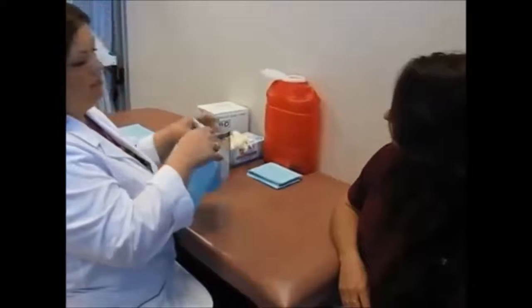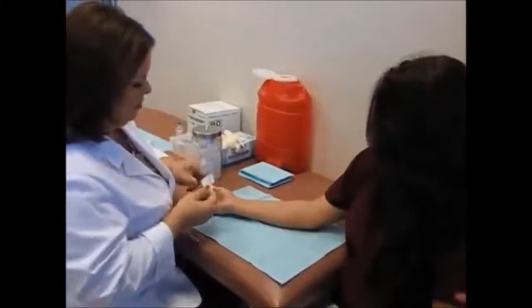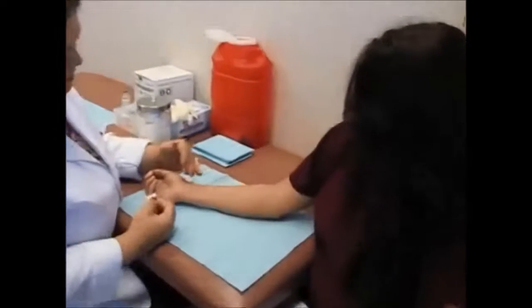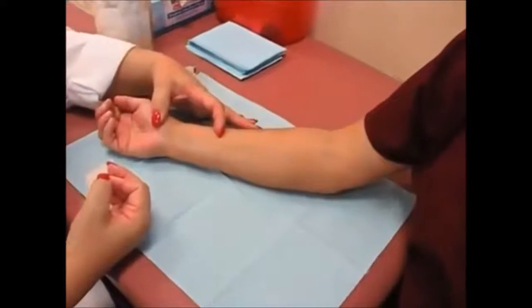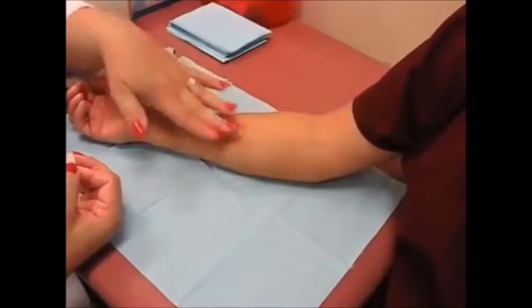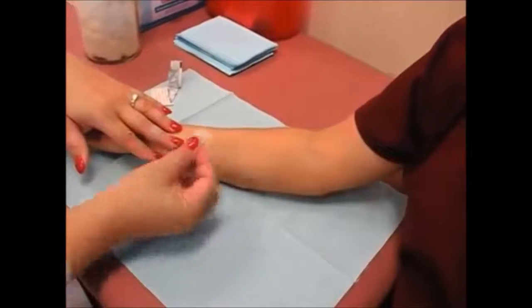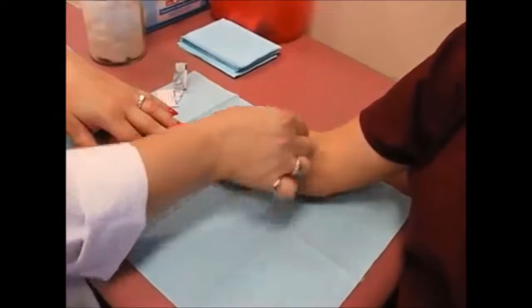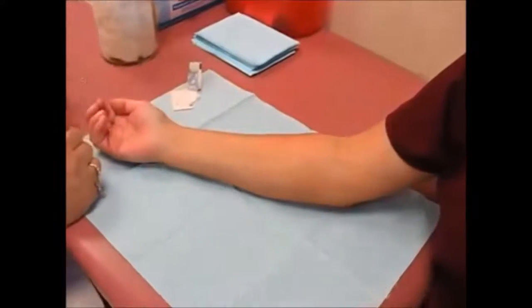So we do this test on your forearm. Do you have an arm preference? How about this one? That arm is perfect. So I'm just going to take a moment to cleanse the site. I'm selecting a site that's away from major blood vessels, so away from these blood vessels and away from these blood vessels. Somewhere right here on the flat side of your arm is perfect. I'm going to cleanse that site in concentric circles, starting in the center, working outward, never crossing the same area.